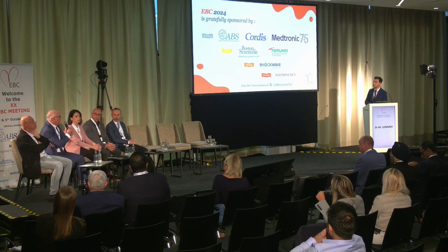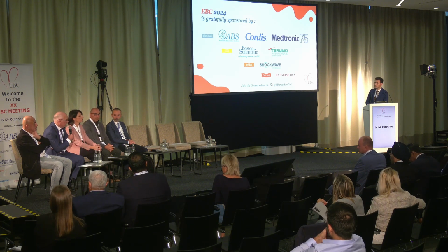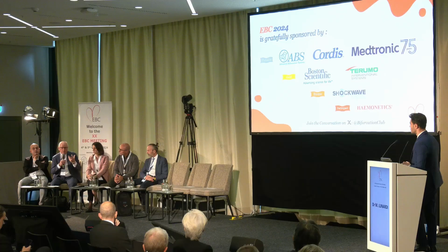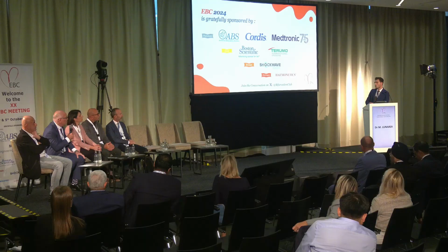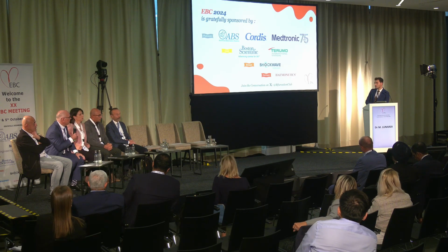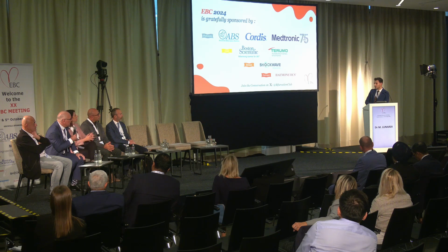Mattia, excellent case, and I think it's a really important discussion, pot side pot versus the traditional kissing, and congratulations on the study. So the first question, imaging is mandatory with your protocol in this study? Yes, with OCT, just one run after the performance of pot side pot or kissing, but the primary endpoint is based on imaging and OCT in particular.